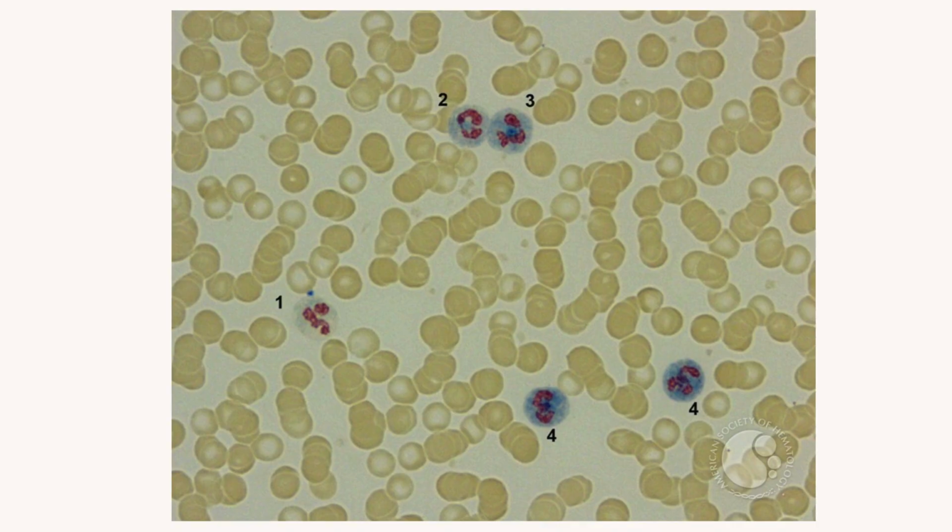So if you see this picture here, each neutrophil is graded according to the intensity of the color of the cell.